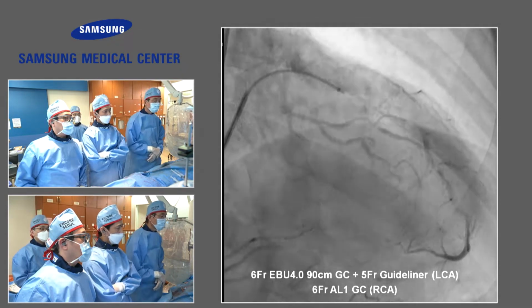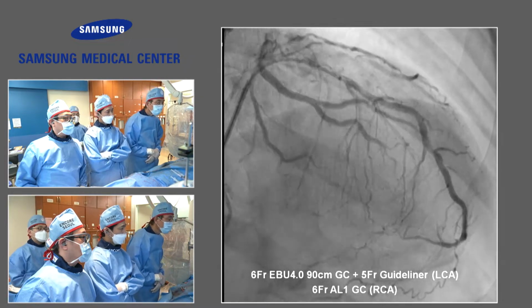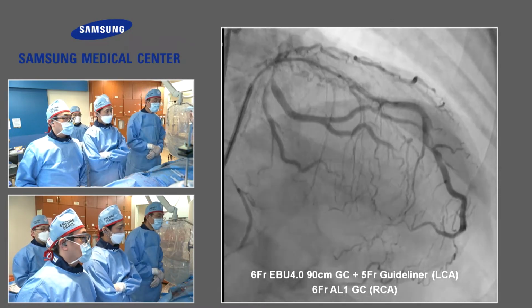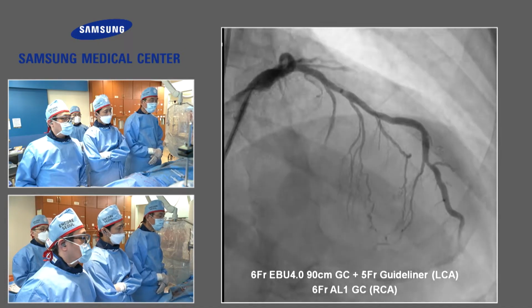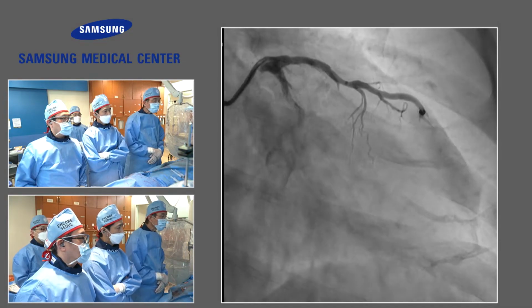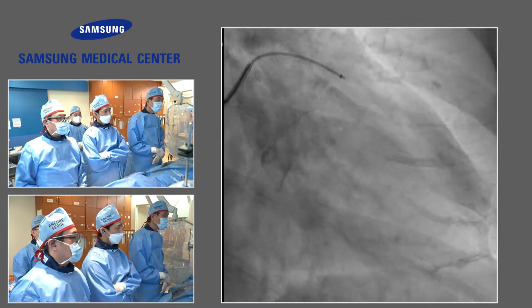Third septal, just above the LAD angle, there are some connections, but it didn't fill the epicardial artery of the right coronary. And the epicardial collateral at the distal LAD is very tortuous. Maybe this collateral is going to the RV branch.